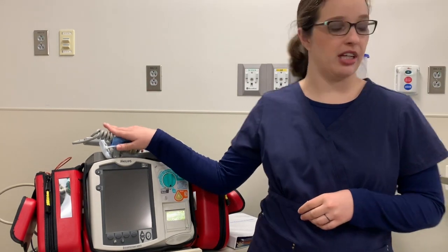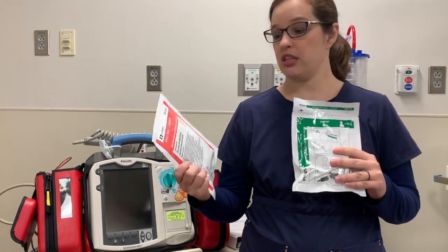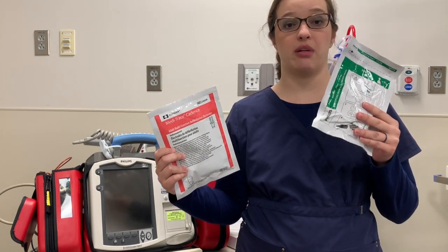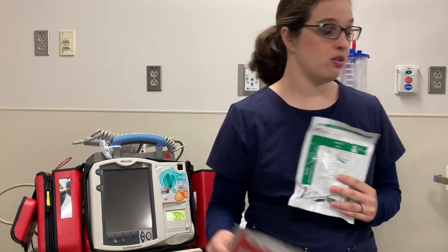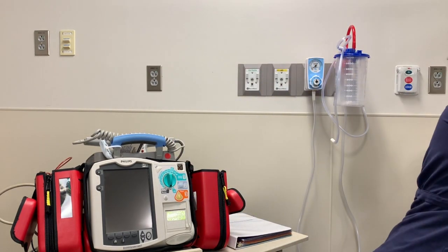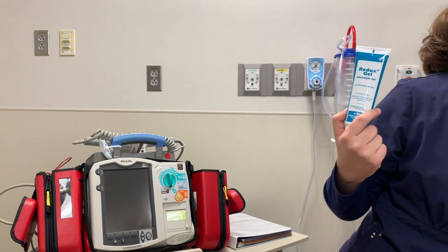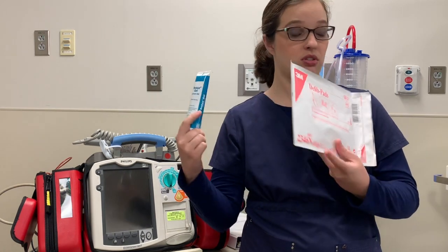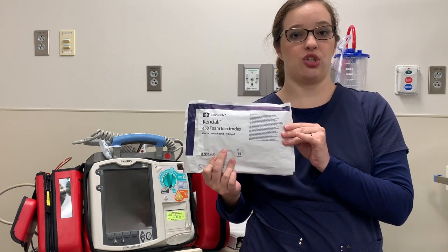To start with, you'll need your defibrillator. You'll also need the pads to attach to your patient. There are adult pads and pediatric pads. Pediatric pads would be used on a patient less than 10 kilos, and adult pads are for any kid over 10 kilos. You could also need your Redux gel or the defib pads if you're using the paddles. Then you'll also need your EKG electrodes.